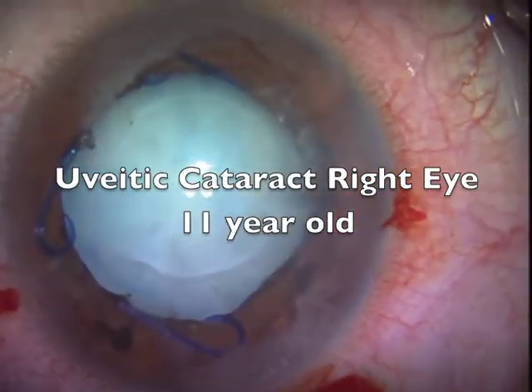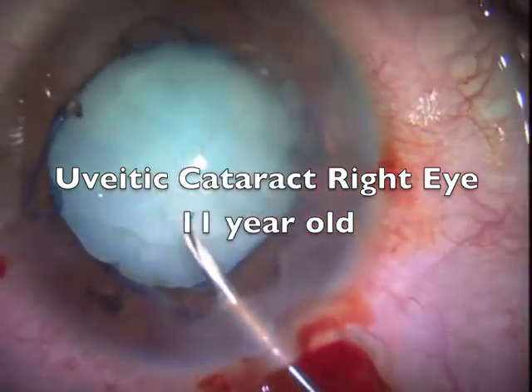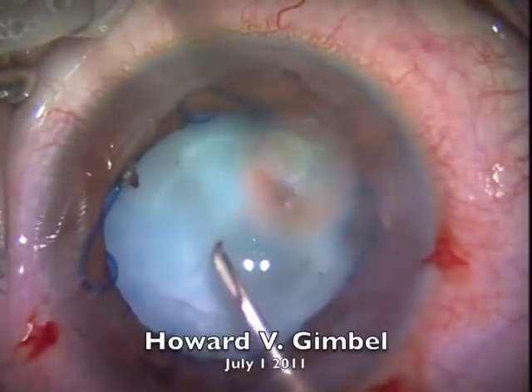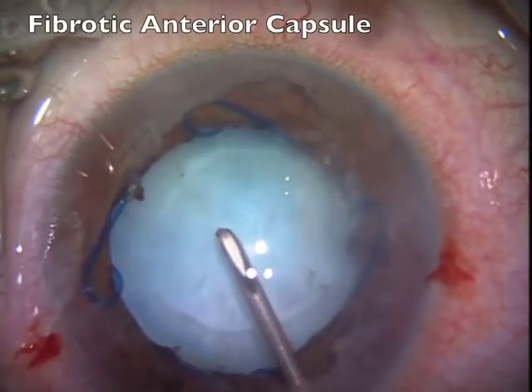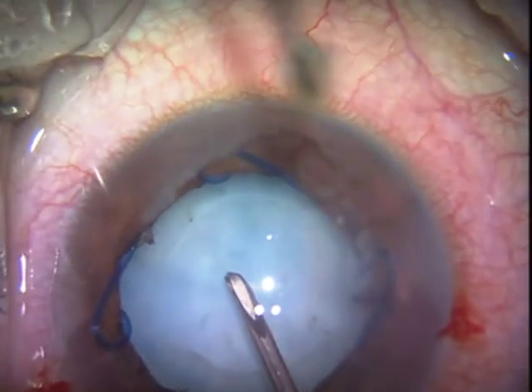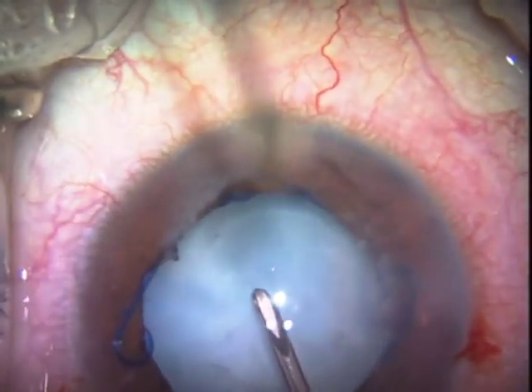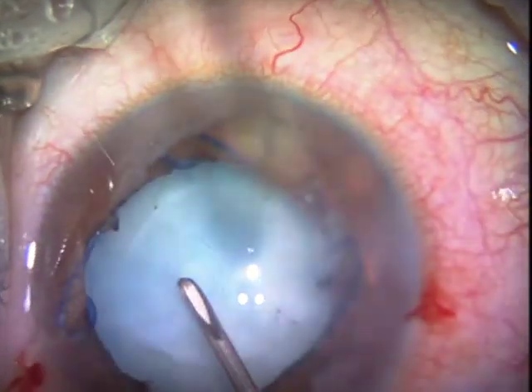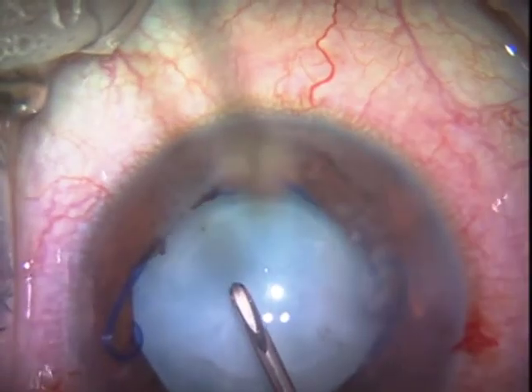This is an extremely fibrotic capsule in an 11-year-old with uveitis since age 2. You can see that even this sharp cystitome is having difficulty puncturing this fibrotic anterior capsule.